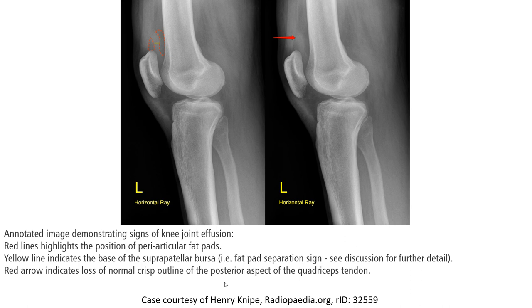This annotated image demonstrates signs of knee effusion. The red line highlights the portion of the pre-femoral fat pad, and the yellow line indicates the base of the effusion.